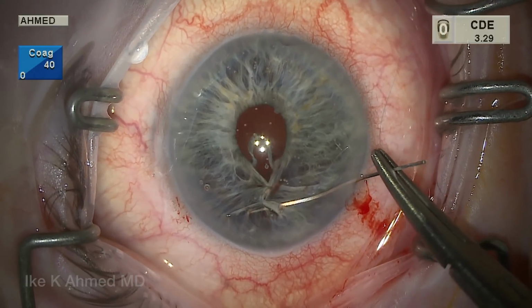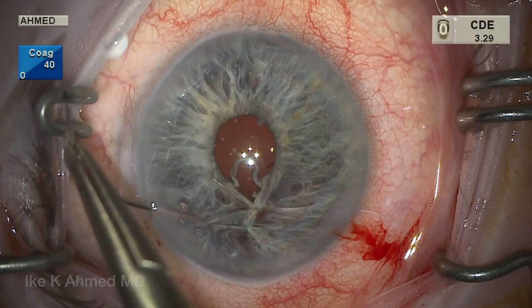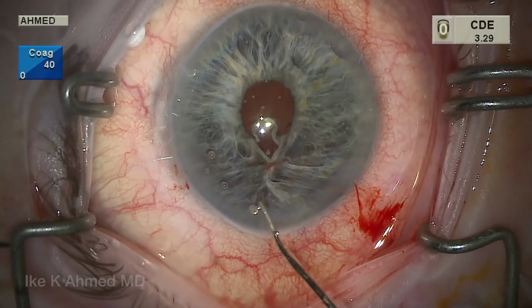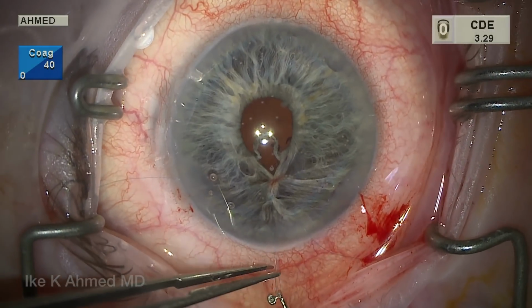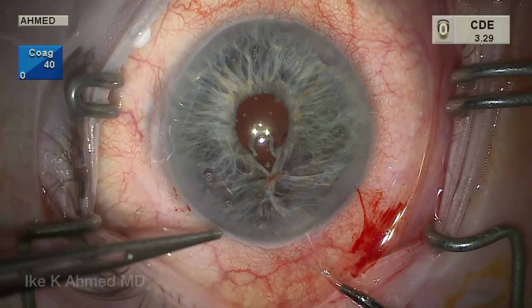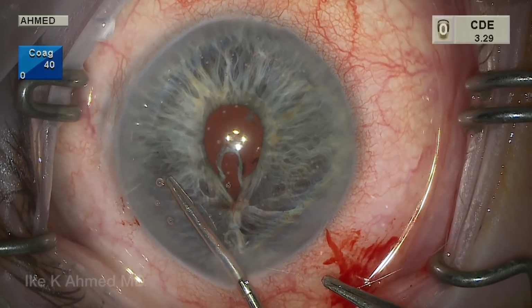Here, although we don't have a frank defect on the peripheral aspect of this tear, we're going to oversew the suture here because of the thinning, atrophic nature of the iris in this area, to reduce the risk of photophobia. A similar technique is used again to tie the suture, and after the suture needle has been passed, locking the suture in place.